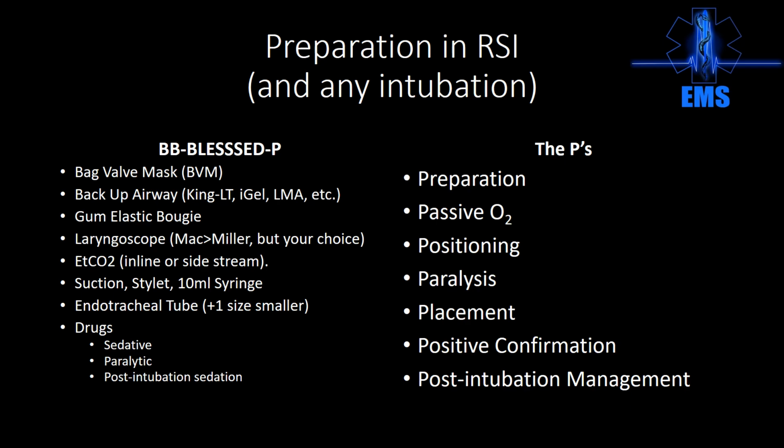Moving on to the right side of this slide, slide 7, the P's. So preparation. This is where being blessed with preparation comes in. Getting all this stuff arranged and looking at it and being prepared to use it is going to save you a lot of mental energy in actually completing this procedure.